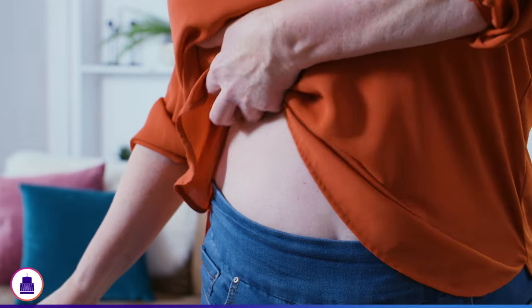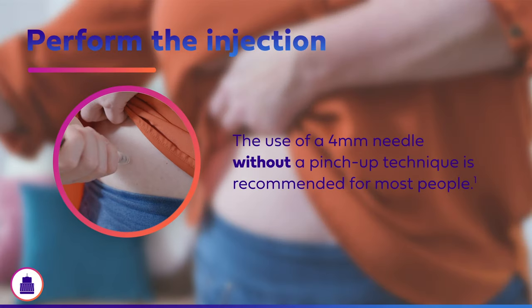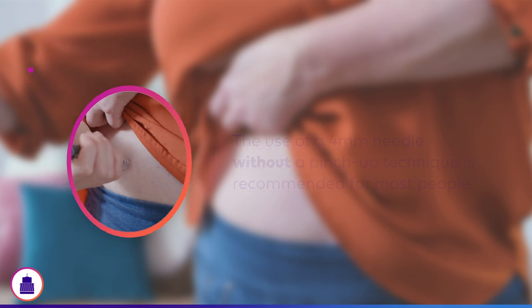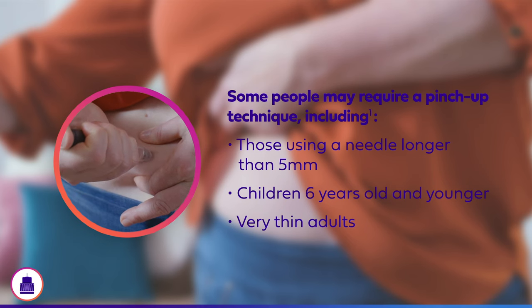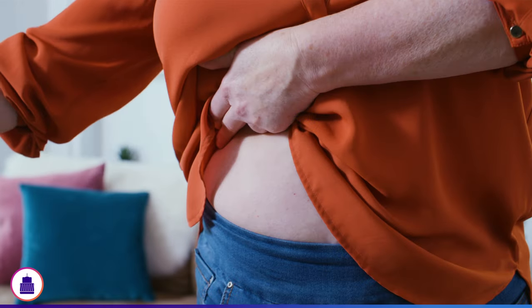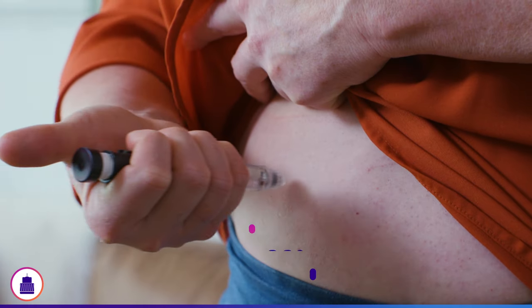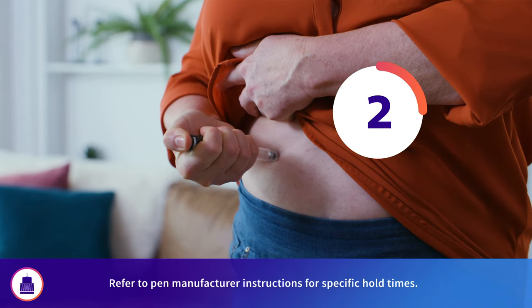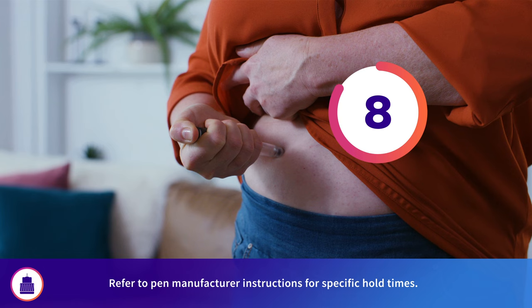Once the injection site has been selected, disinfect the skin with an alcohol swab. Since we are using a 4mm pen needle, the use of a pinch-up technique is not recommended for most people. However, those using a needle longer than 5mm, as well as children 6 years old and younger and very thin adults, may require a pinch-up technique. Grip the pen in the palm of your hand. In one continuous motion, insert the needle into the skin at a 90 degree angle. Then press and hold down the pen's injection button to administer the dose, holding for up to 10 seconds to ensure the entire dose has entered your body.